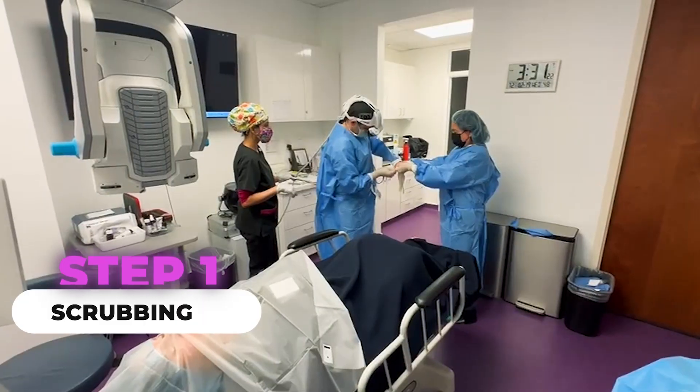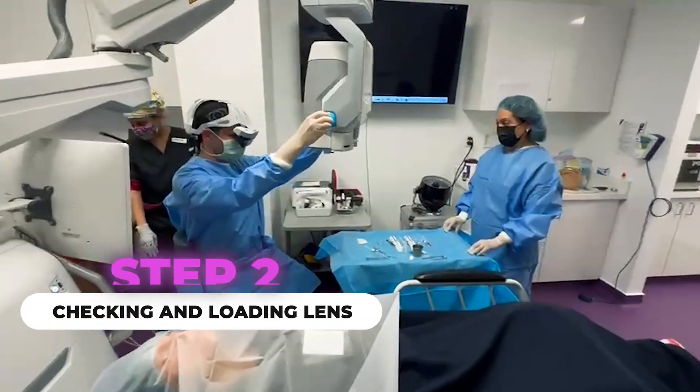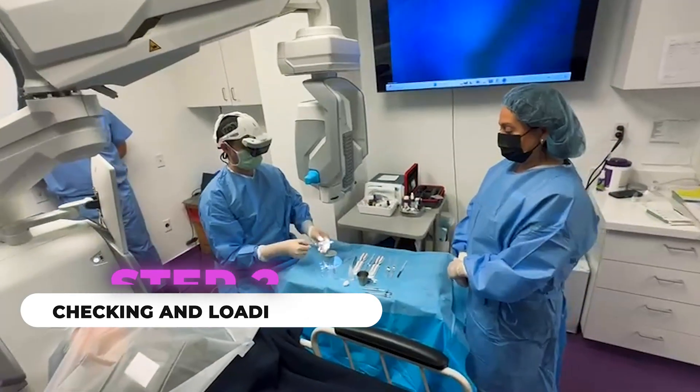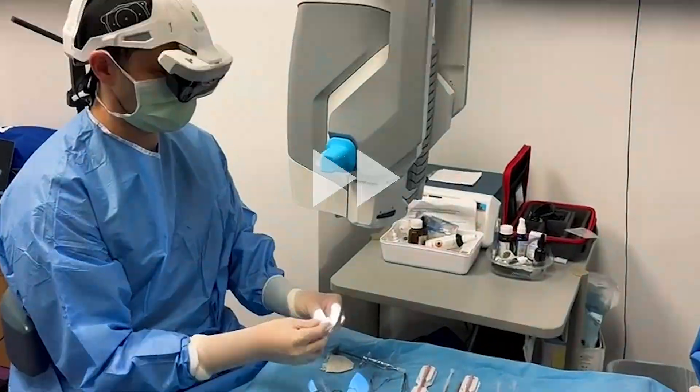I'm putting on the digital 3D headset that allows me to see everything I need during the procedure, just like a traditional microscope would, except in a three-dimensional upright view. It's a virtual image — really, really cool.